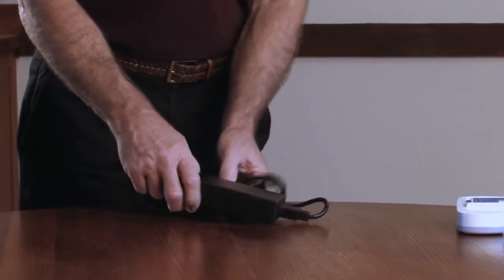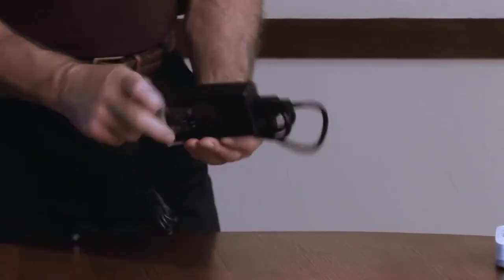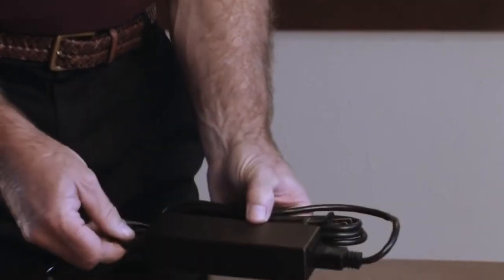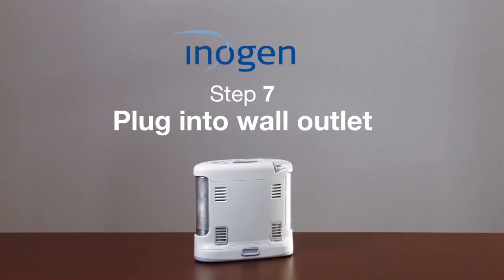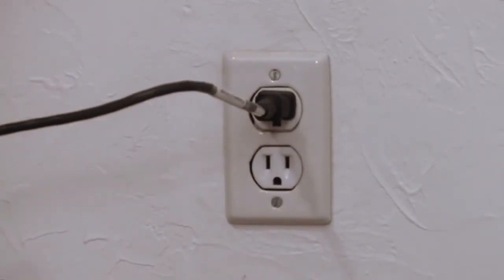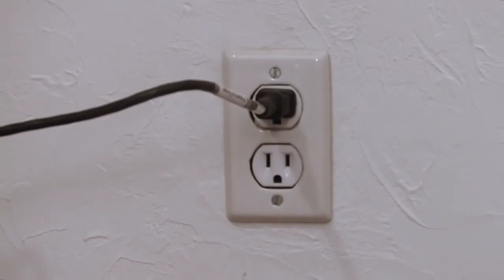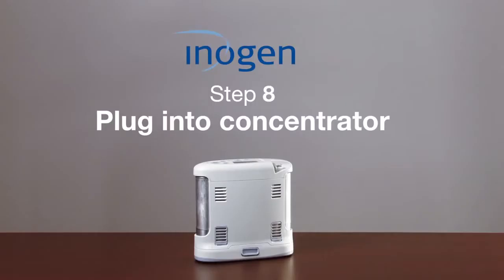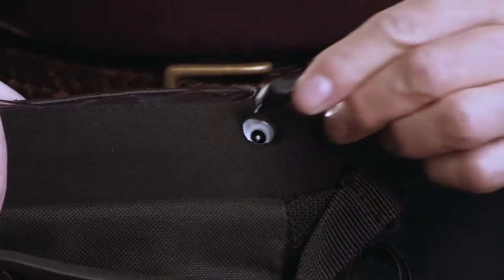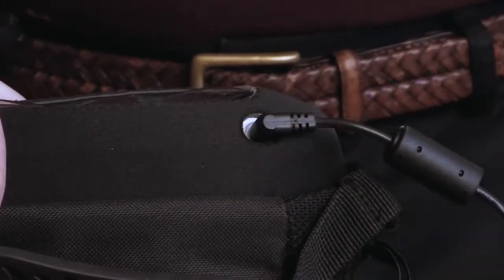Locate the AC power supply and ensure that the AC input power cord is connected to the power supply. Plug the AC power plug into the nearest electrical wall outlet. Plug the power output plug into the top of the G3 concentrator.